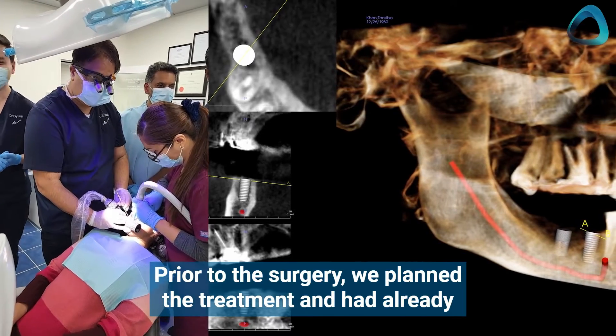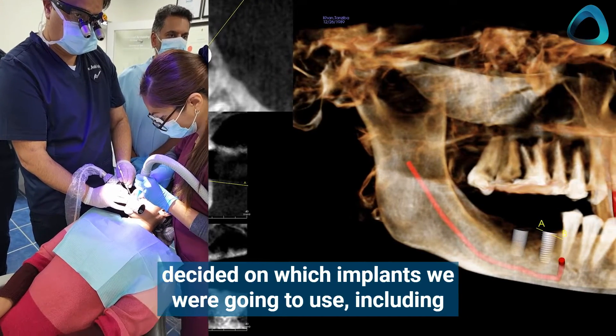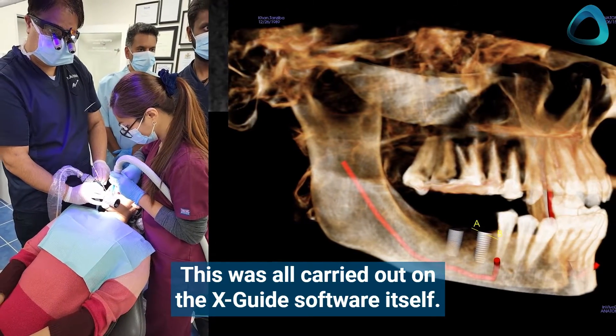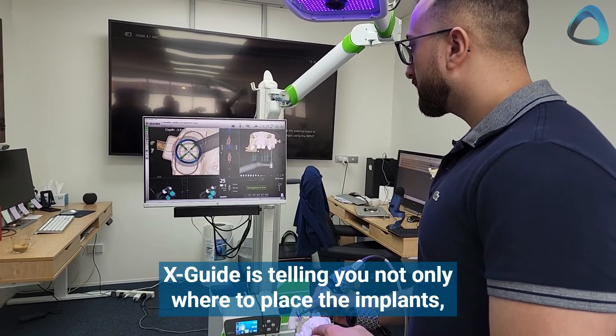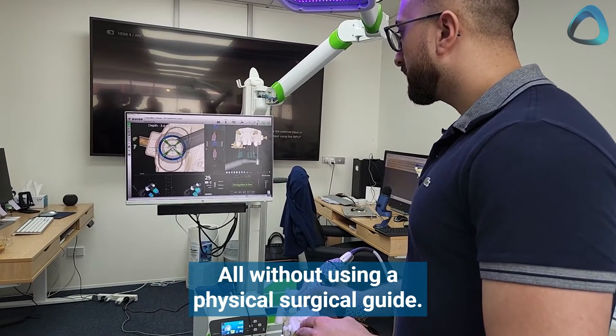Prior to the surgery, we planned the treatment and had already decided on which implants we were going to use, including the sizes, heights, and position. This was all carried out on the XGuide software itself. On the screen you can see the instructions — the XGuide is telling you not only where to place the implants, but also the angle and depth, all without using a physical surgical guide.